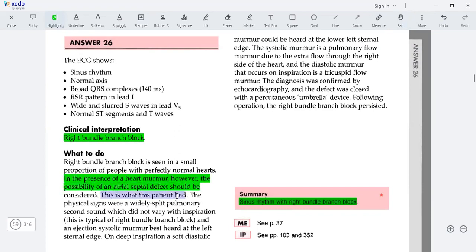Let's check the diagnosis. With presence of heart murmur, the possibility of ASD should be considered. This is what this patient had: split second heart sound, fixed and wide splitting of the second heart sound that did not vary with respiration, typical of ASD. Our diagnosis was correct: RBBB most likely due to an ASD.